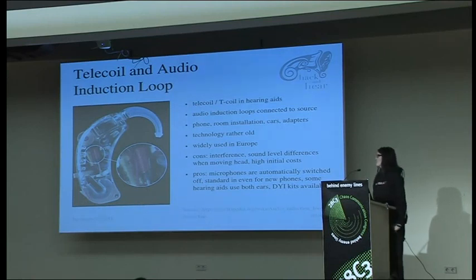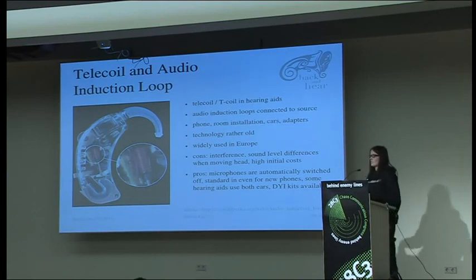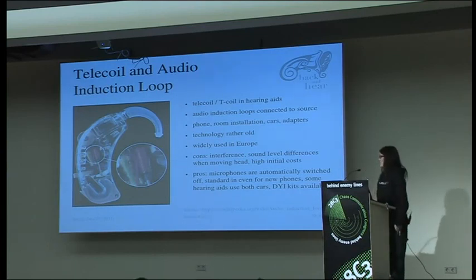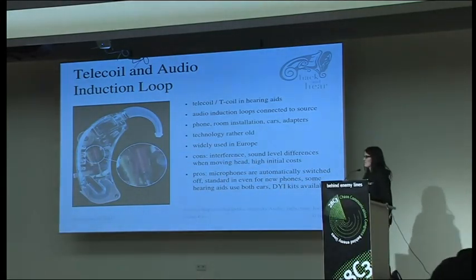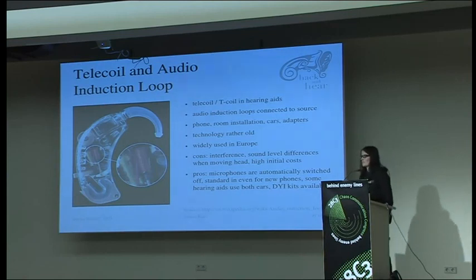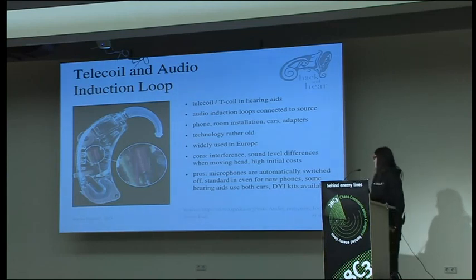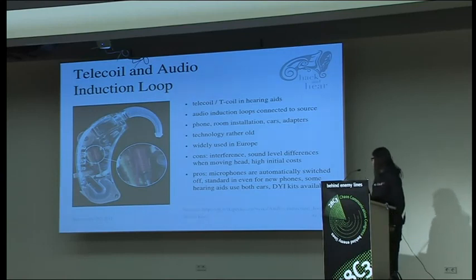You have some pros and cons, of course. You have interference. When you move inside the induction loop, the level of volume changes. So it's nothing where you should dance or something, but if you sit still in the theater or something, it works. Installing an induction loop is quite expensive, but there are actually DIY kits available. It's quite common that people build their own.